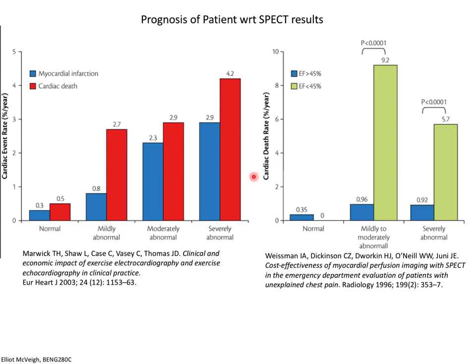And then similar with SPECT, where you also take into account the ejection fraction. If you have a positive SPECT and your ejection fraction is low, that means that movie showed that the heart is contracting quite abnormally and that it's not ejecting much blood, then that really boosts up the probability you're going to have an event.